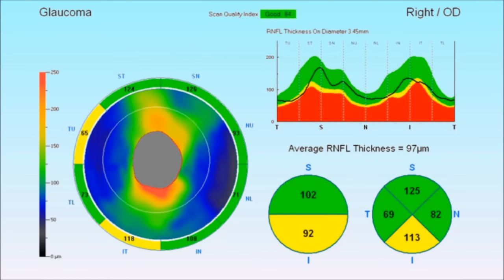In glaucoma the transparent nerve fibers that take the visual signal to the brain atrophy away. The OCT scan can visualize the thickness of this transparent nerve fiber layer and so atrophy can be detected early.